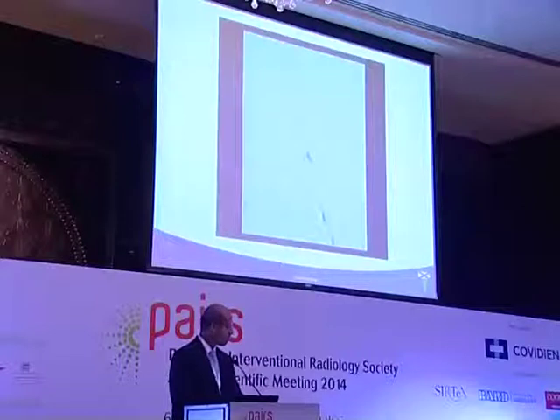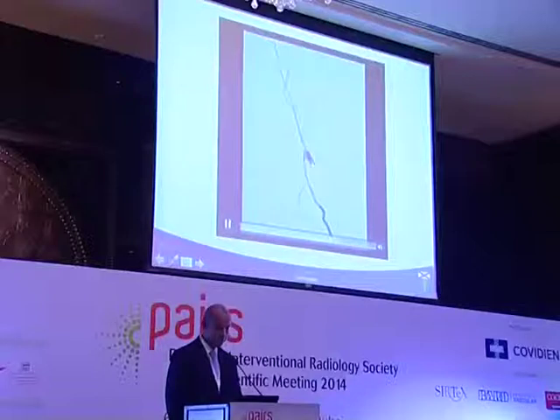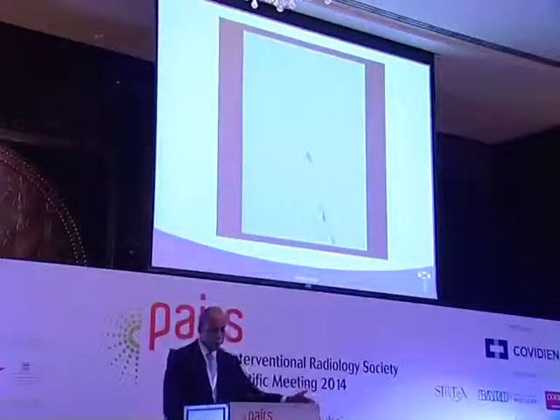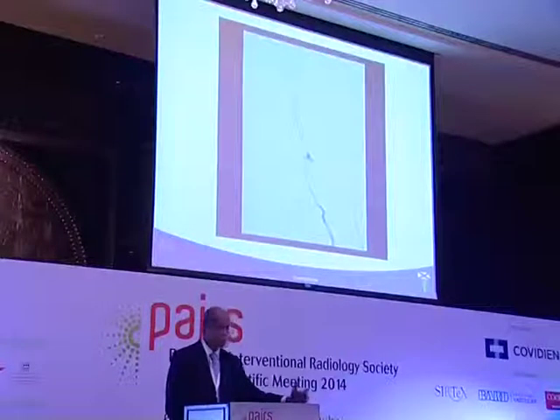Why did you leave that aneurysmal part behind? Because number one, I don't think there is enough data to understand the long-term meaning of this. Covering it, the only thing it was going to do was extend the length of the segment covered, which in theory could increase the risk of having further issues. So my view was short, sweet, out.